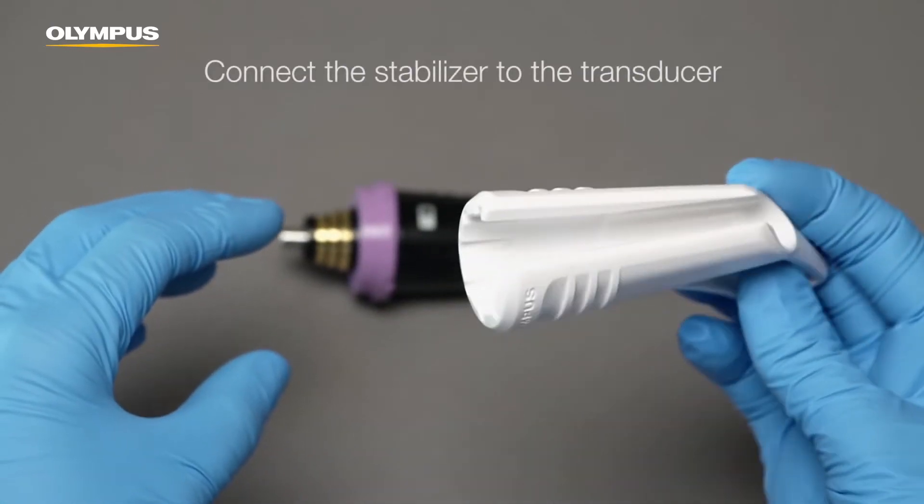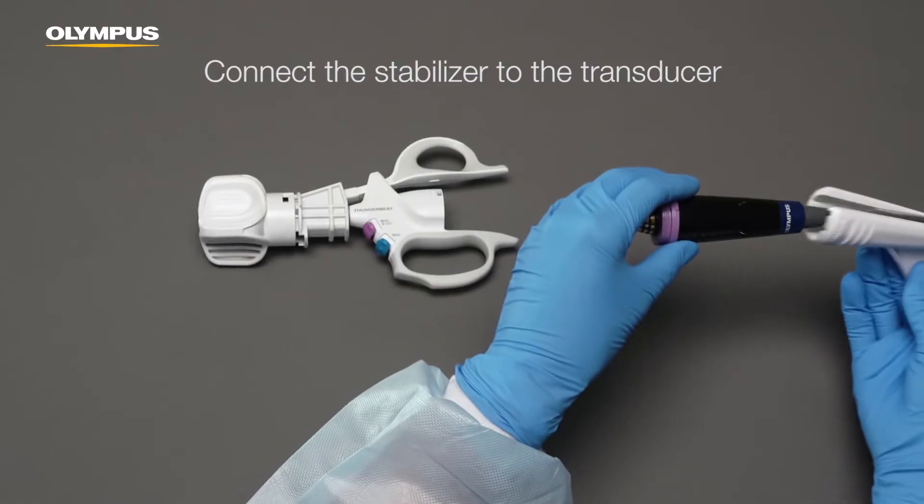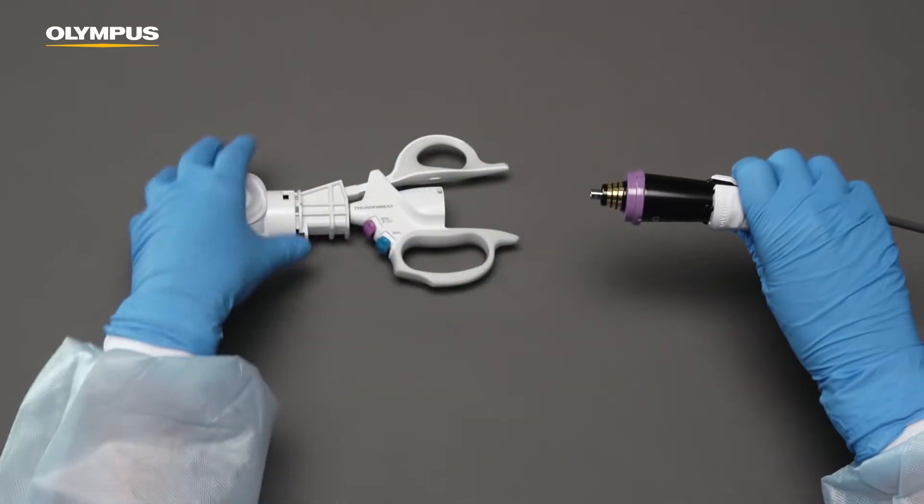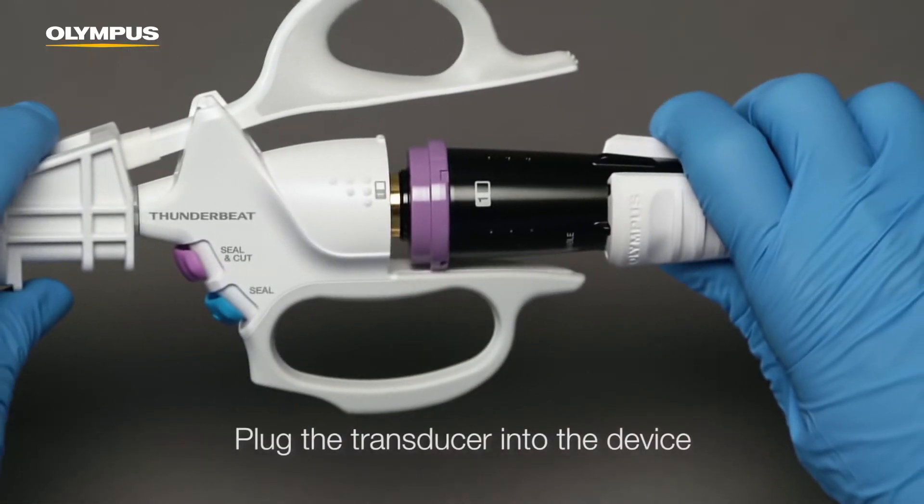Then, connect the stabilizer to the transducer. Grab the torque wrench and connect the transducer to the device.